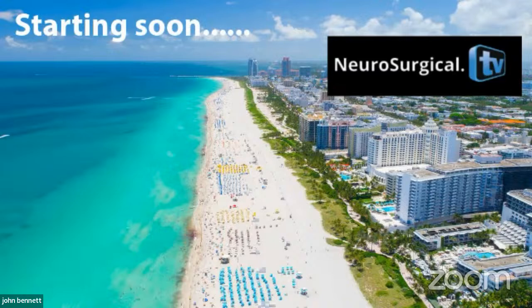I left a little residual droplet of tumor on the sixth nerve to avoid injury, and a little bit of residual tumor was left here on the seventh nerve. And then we'll do a dural reconstruction with fascia lata. We seal off the middle ear, and we pack the area with fat, the mastoid dead space. Again, don't overpack the temporal fossa. You can result in compression. And this was a near total removal, but radiographically gross total.